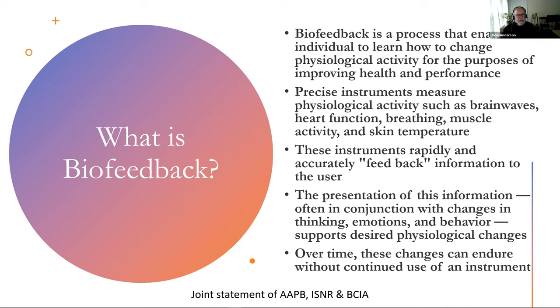So the presentation of this information in conjunction with changes in thinking, emotions, behavior, that sort of thing, supports desired physiological change. Now, the goal of this entire process, whether it's general biofeedback or neurofeedback or whatever, is for the changes to endure without the continued use of an instrument. We want to give the client skills and abilities that they can use in their daily lives on an ongoing basis, that they don't have to have refreshed over and over again.